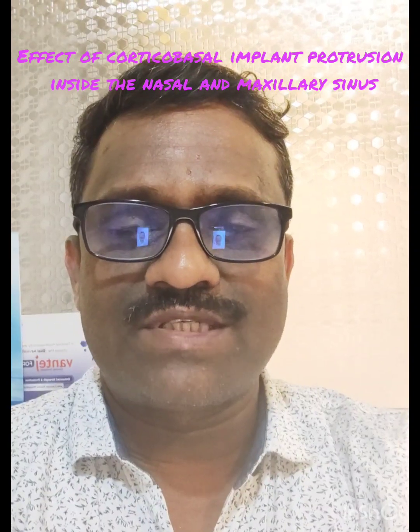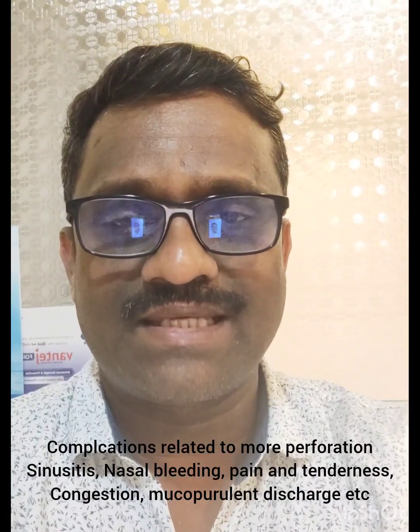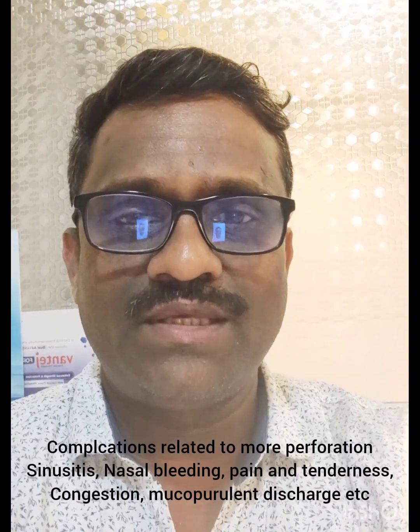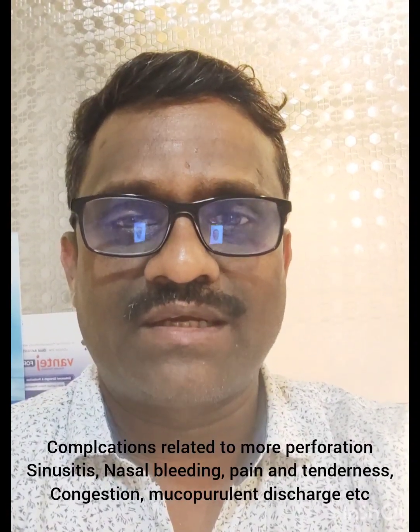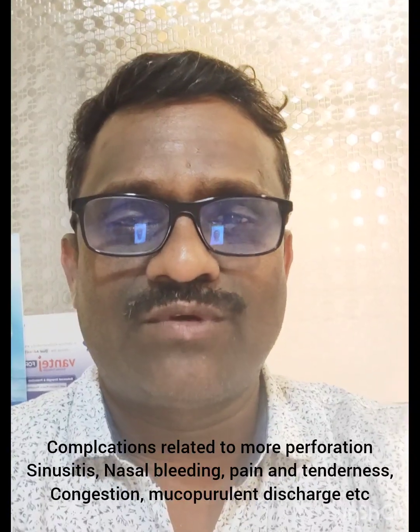So what are the side effects the patient may experience after the placement of the implant? Sinusitis or epistaxis into the nose. These are all the complications that may occur, but usually these complications will not occur if the implant length penetration is up to 4 to 6 mm.